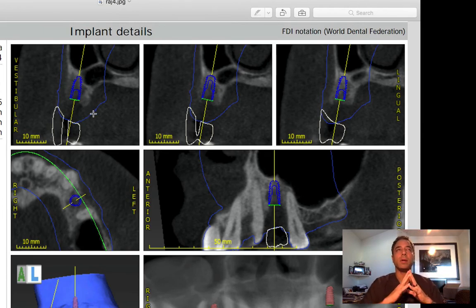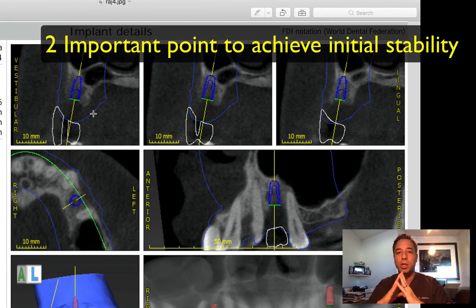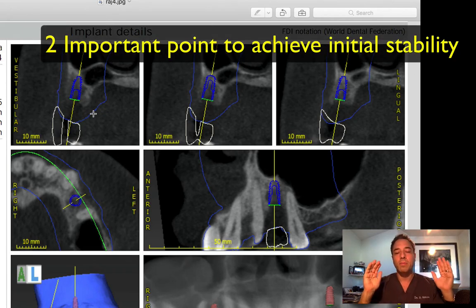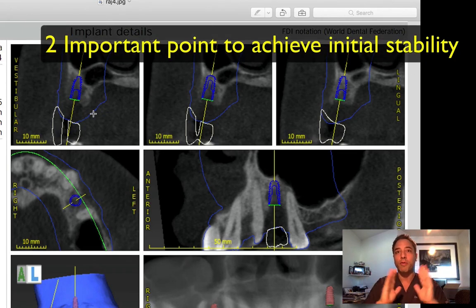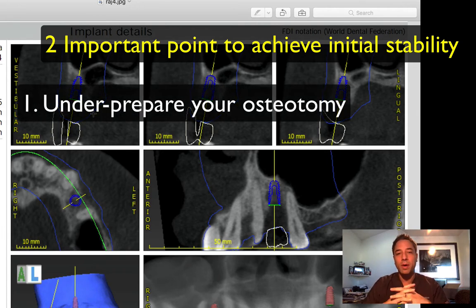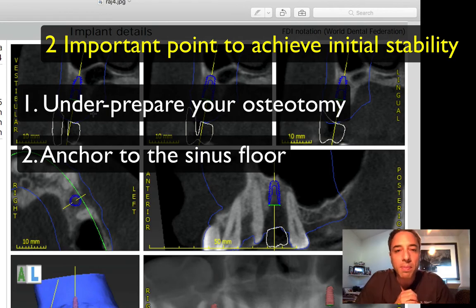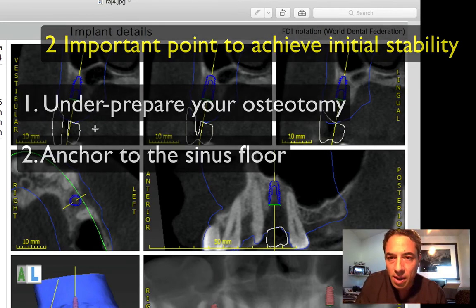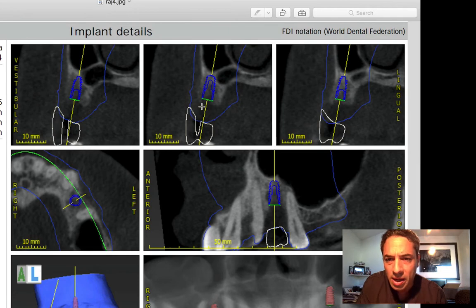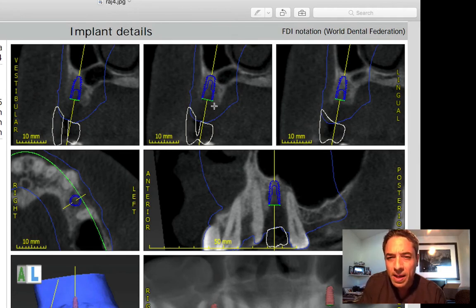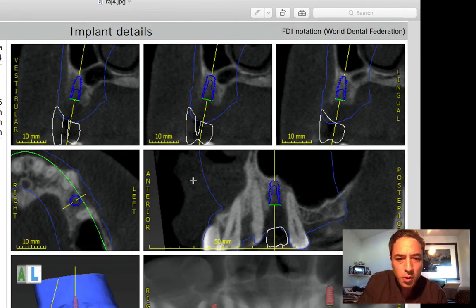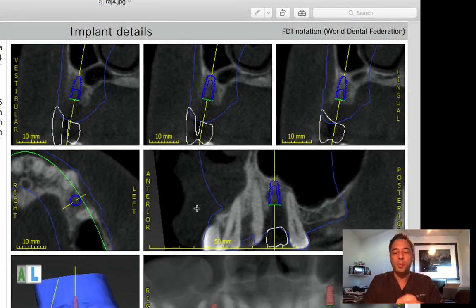So two things to get good initial stability: don't over-prepare — actually under-prepare the osteotomy. Go with one less drill and definitely engage into this apical area. I think your length is great. I don't think you can go with any longer implant. You want to be at the crest or slightly below. So I think this implant is good to go.